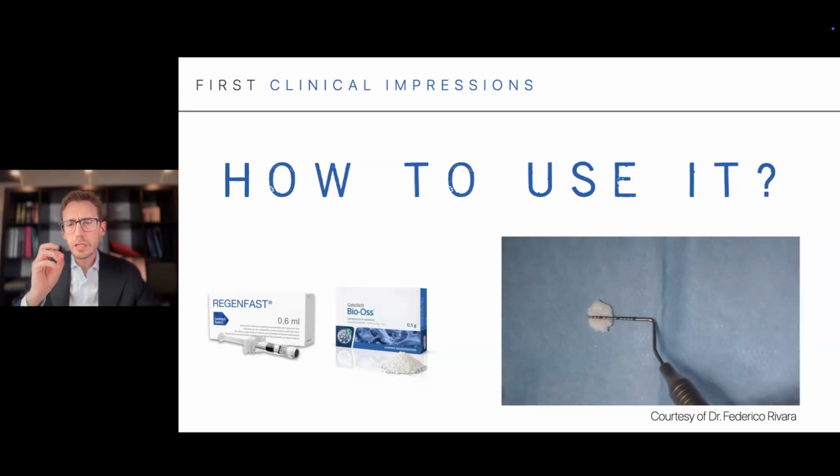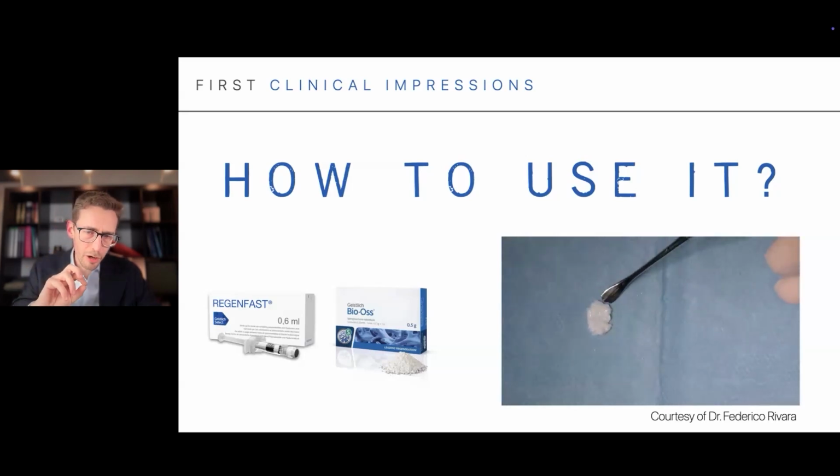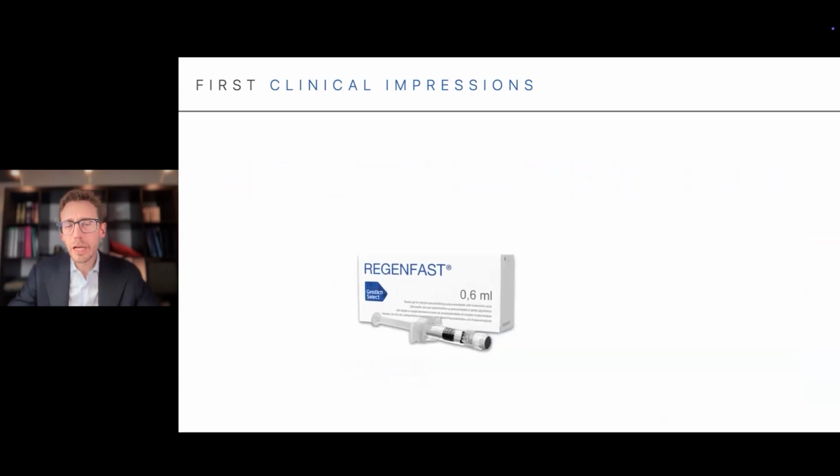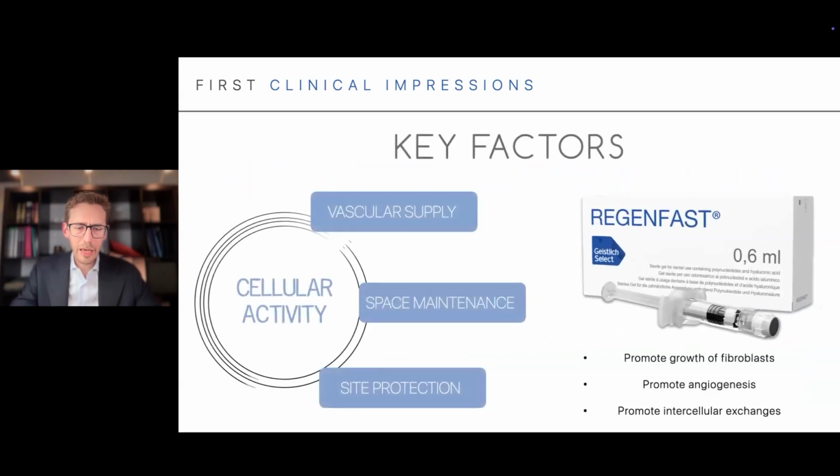This, of course, is an attempt to take advantage of the mechanical properties of hyaluronic acid. But let me say that, in my mind, it's an approach that has no respect whatsoever for the biological properties of the product, because we have stated that this product targets living cells and promotes increased vascular supply. And I'm sure we can agree on the fact that there are no living cells inside our Bio-Oss or inside any bone replacement graft that you're using outside of autogenous bone.